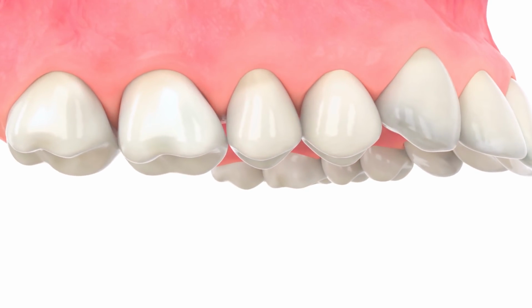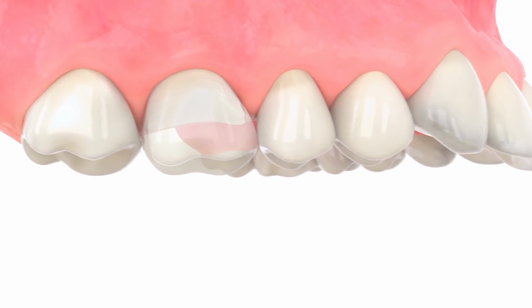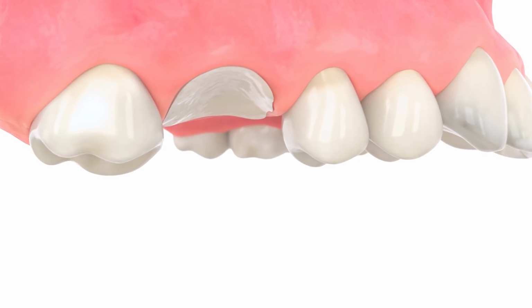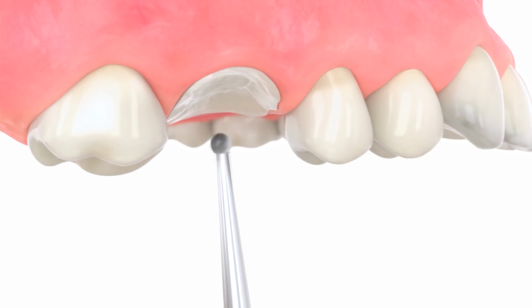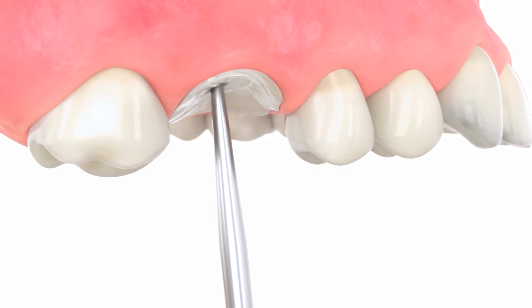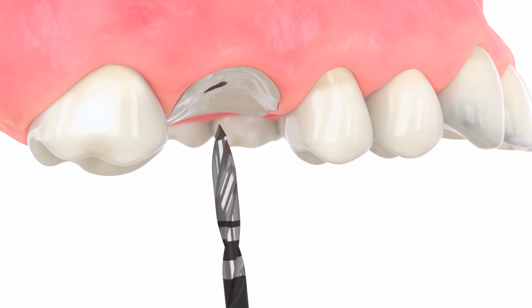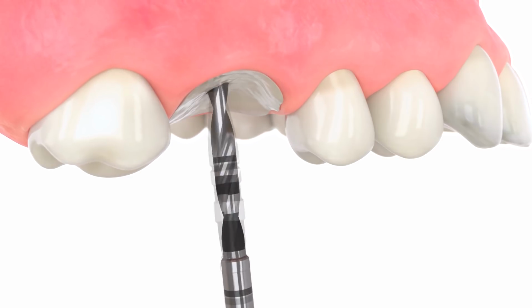To help initiate the osteotomy in the ideal location, the tooth may be decoronated, leaving the roots in place. Identify the ideal location for implant placement and initiate the osteotomy using a round burr. Continue to develop the osteotomy using the 2.0 and 2.5 mm tapered HD drills.